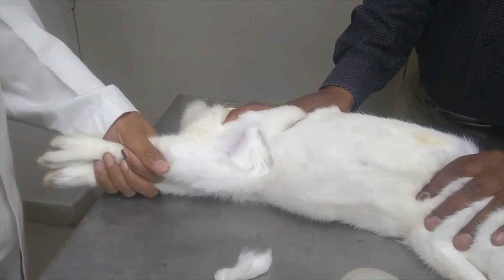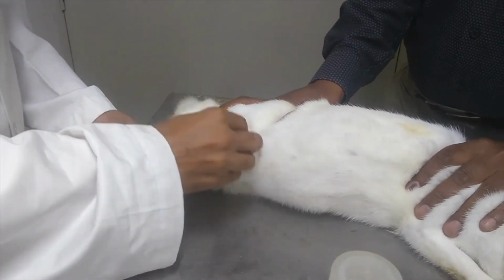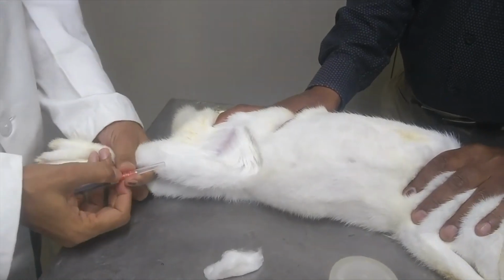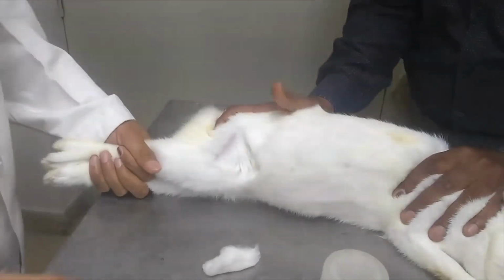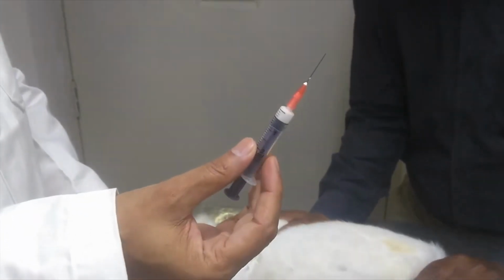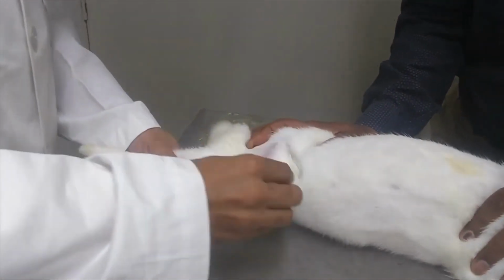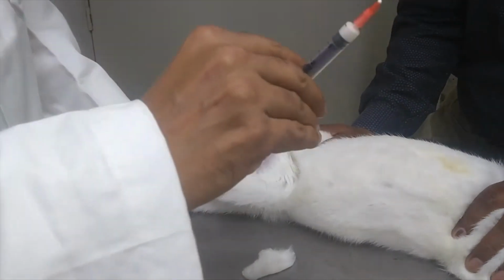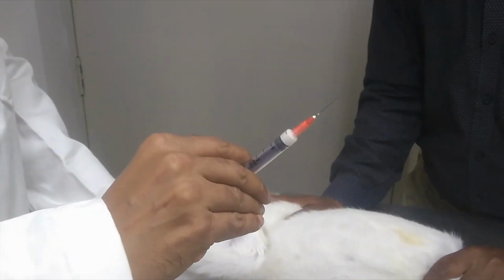There are two kinds of injection that we give. One is intradermal and another one is subcutaneous. So today we'll be doing a subcutaneous injection. This is our emulsion that we have prepared by the microemulsifying needle, as we have seen earlier. This is the area where we would like to inject. We have to take out all the air from the syringe and the needle.